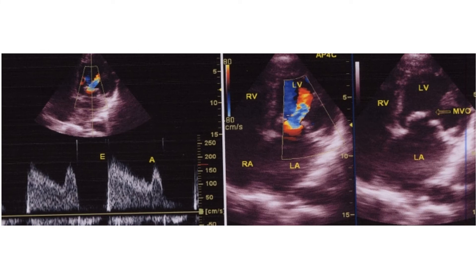The second panel shows two pictures: one with color flow mapping and another without. The color flow mapping shows the turbulent flow from the left atrium to the left ventricle through the stenosed mitral valve. The domed mitral leaflets in the open position with a narrow orifice are visible in the frame without color flow mapping. Doming of the mitral valve is due to commissural fusion, preventing full opening of the mitral leaflets in diastole. Both images are in the apical 4-chamber view.